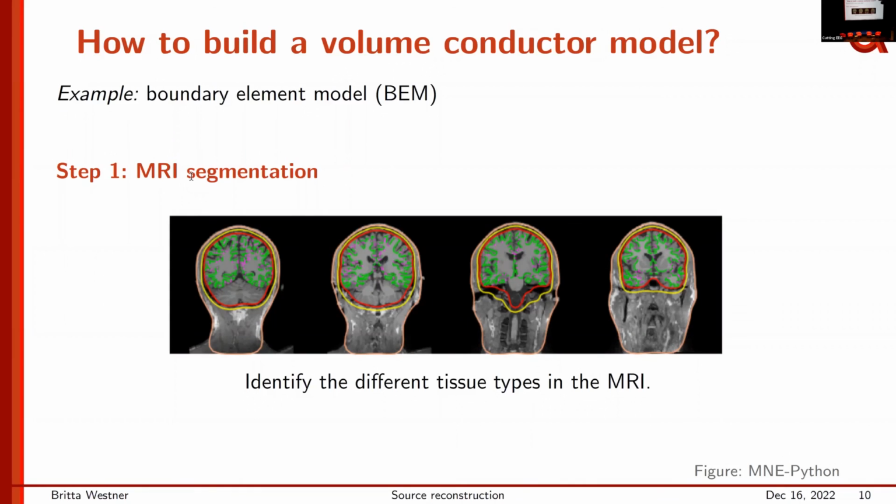So what are your recommendations about that? Yeah, that is an excellent question. Let me start with the latter one first, which is whether you should clean your data differently for beamforming and sensor analysis because of this rank deficiency you might get if you employ ICA. Again, unsatisfying answer, it depends a bit.